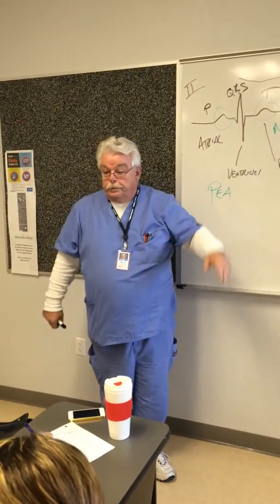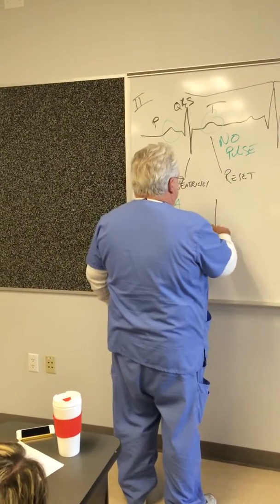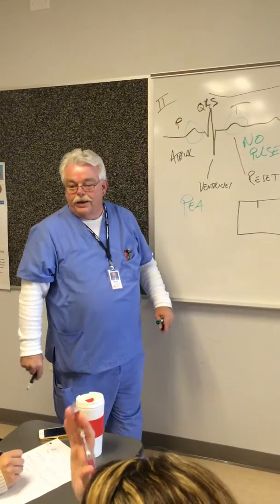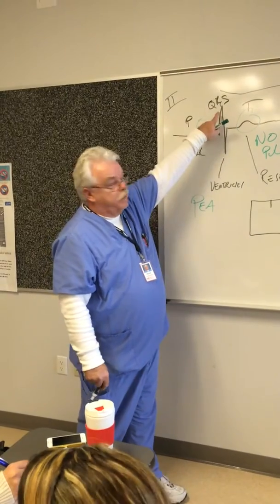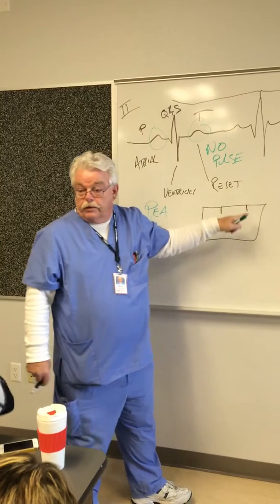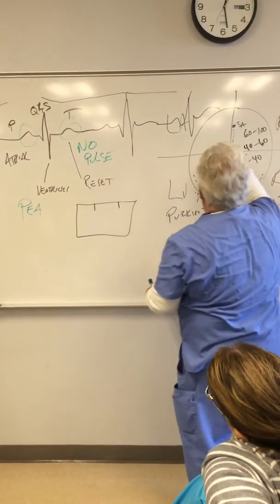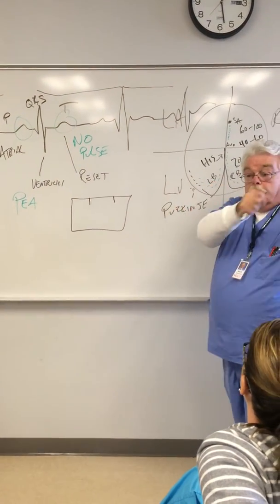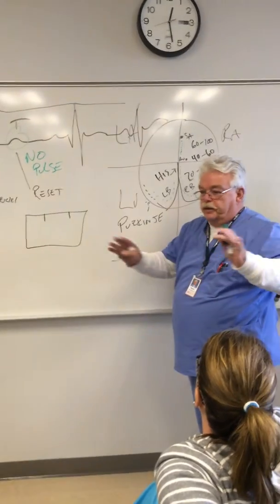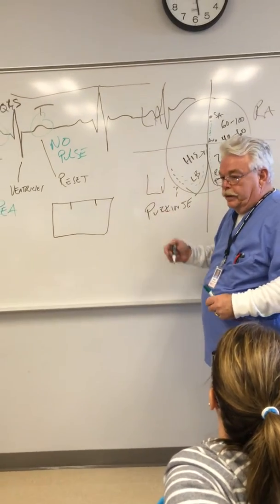You're checking to make sure there's the same number of boxes between each P or R. Don't make it too hard. Get a piece of paper, put it there and make a mark on the R peaks. Without moving the paper, make a mark where the next one is. Slide the whole piece of paper down to the third one. That mark should line up on the next QRS. That's how we're checking it's regular. Don't count boxes, don't divide by 7, don't figure out how many human souls Pedro can buy. Just do that. That's it. That's regular.